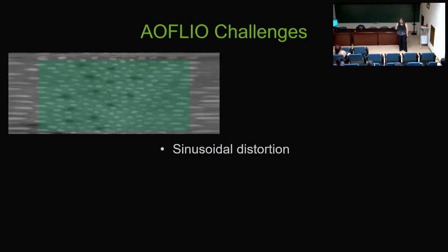As we move forward, I mentioned a couple times, the images are lower resolution than we would like. And there's a lot of challenges that we faced in doing the fluorescence lifetime imaging with our adaptive optics scanning light ophthalmoscope, particularly because of the speeds that we're imaging. A lot of the fluorescence lifetime techniques have been developed for use with microscopes where you can sit for a longer period of time on each pixel and dwell on each pixel, capture enough photons, and then move to your next pixel. We don't have that luxury because we're imaging at approximately 25 hertz.